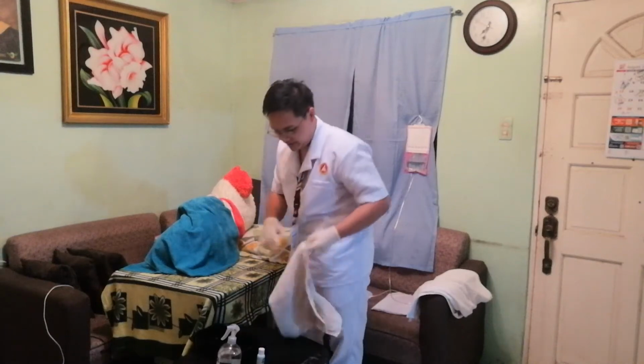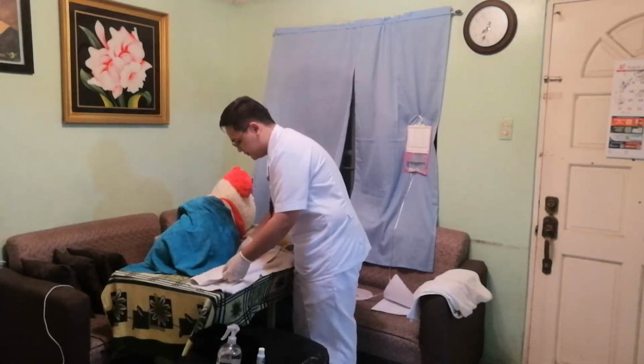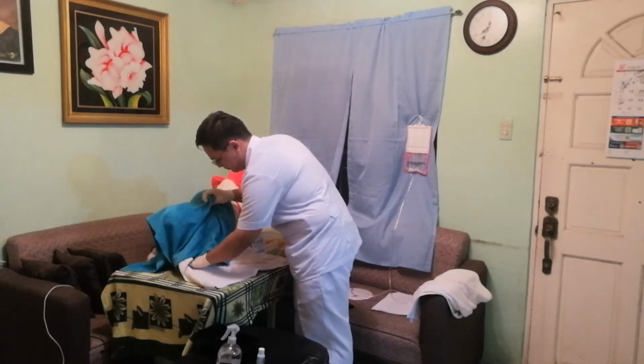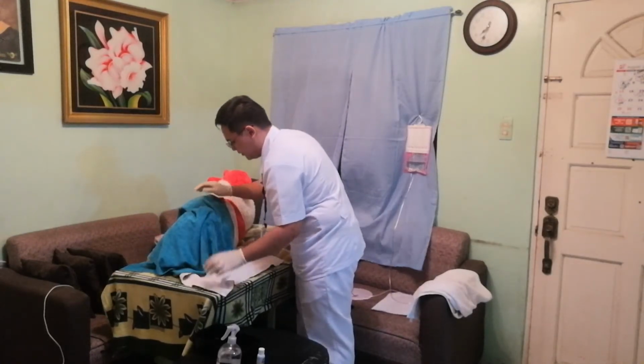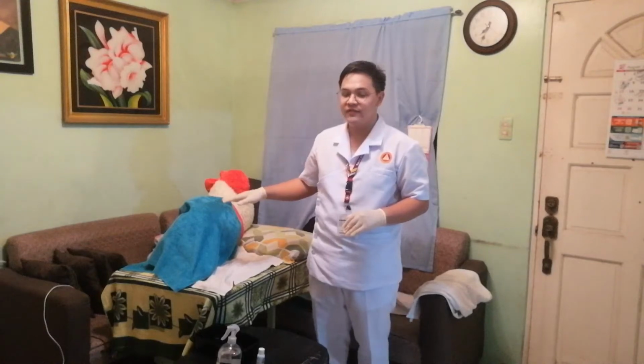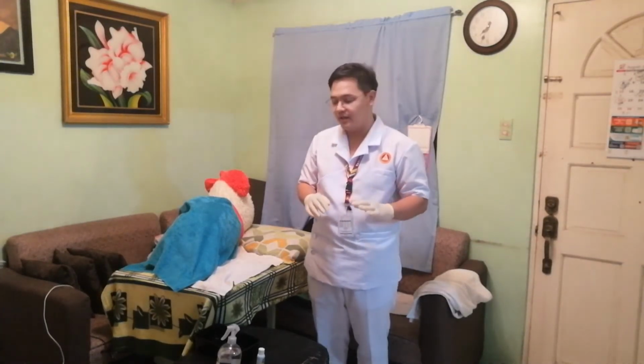After that, we will now be putting the disposable linen saver pad under the patient's buttocks. And after that, we will need to insert now the enema tube to the client's rectum. And for the client that is on the left lateral position, we will need to lift the buttocks or separate the buttocks so we can see the patient's anus.